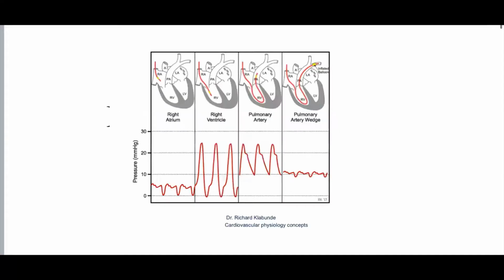If I take the first slide, this one, what do you think this catheter is doing? What's the name of this catheter? Any idea? Trying to get the wedge pressure. This is the Swan-Ganz catheter. Exactly. Thank you, Fikri. Thank you so much. So this is the Swan-Ganz catheter.